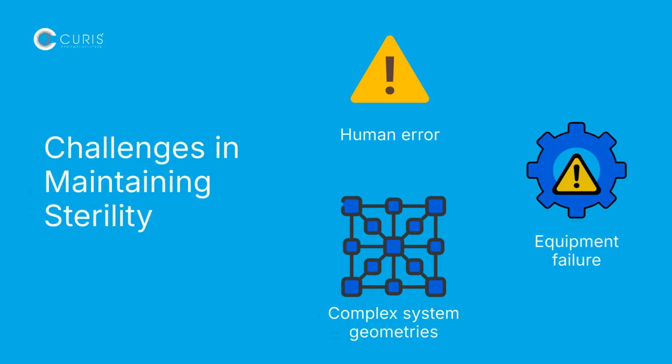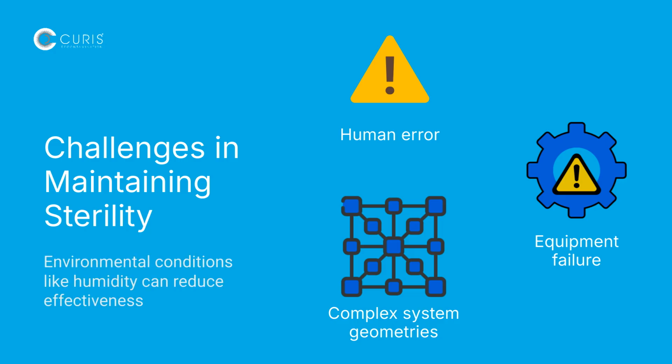Sterilization is not without risk. Human error, equipment failure, and complex system geometries can all compromise outcomes. Environmental conditions like humidity can reduce effectiveness, while some chemical sterilants pose safety and environmental concerns. These challenges demand rigorous validation, disciplined procedures, and continued innovation.